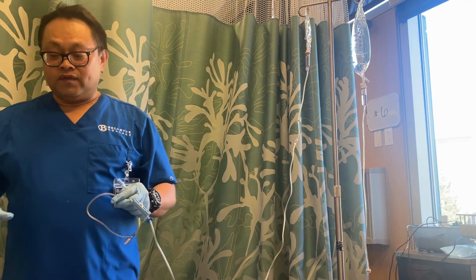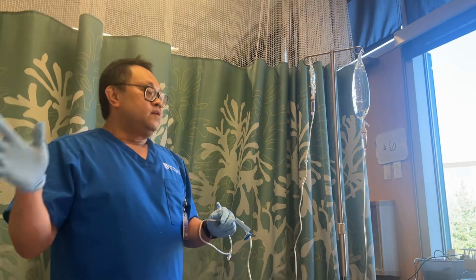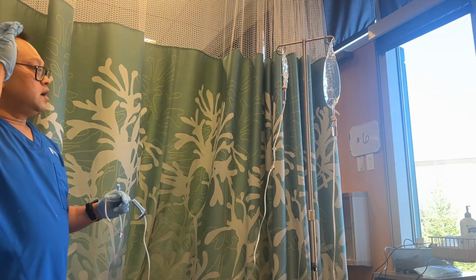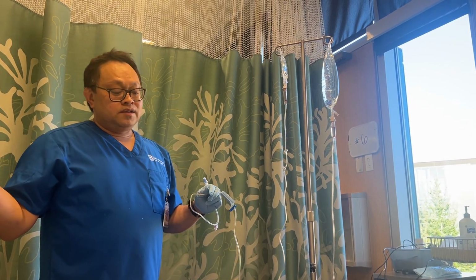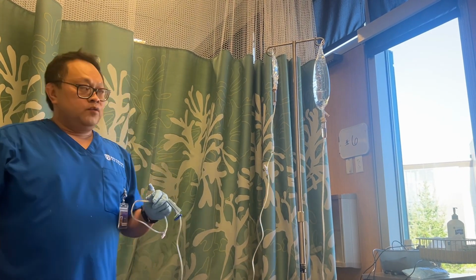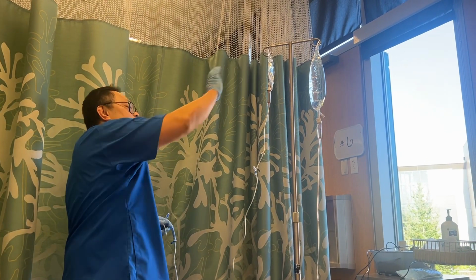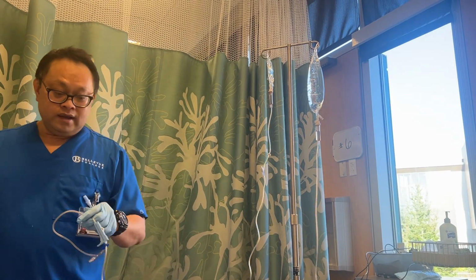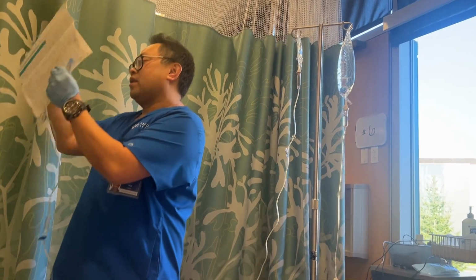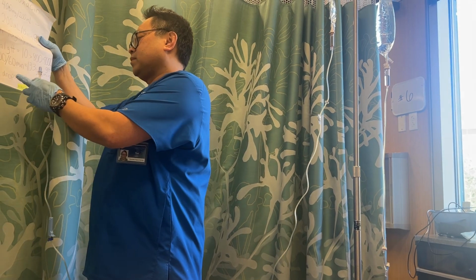I need to provide client education. For the Ondansetron, it is for nausea and vomiting, so it helps with your nausea and vomiting. For the normal saline, it would be for fluid balance, and for the ciprofloxacin, because you've been having a UTI, this is an antibiotic. Okay, so now we explained the flow rate for the sodium chloride. Now the flow rate for the ciprofloxacin is 44 drops per 20 seconds.